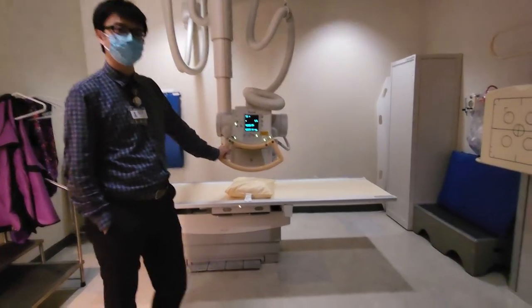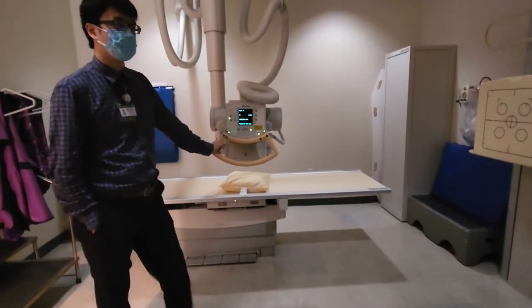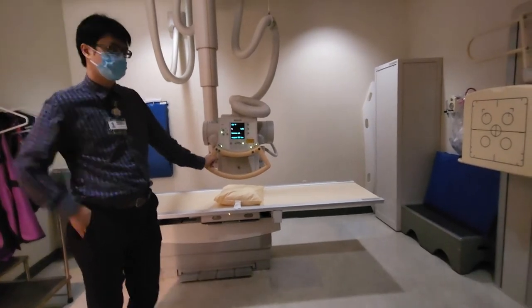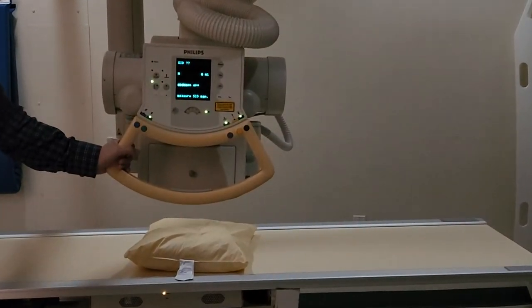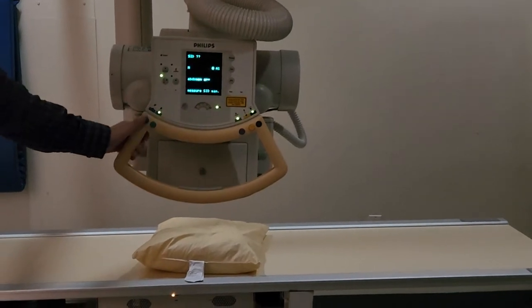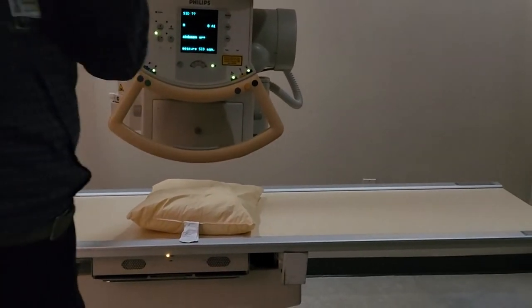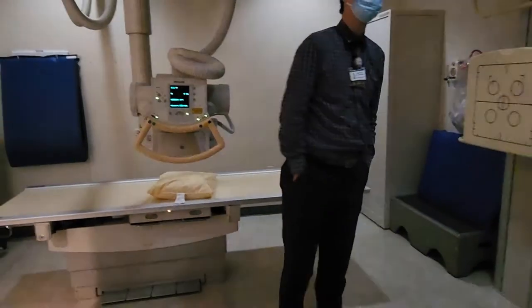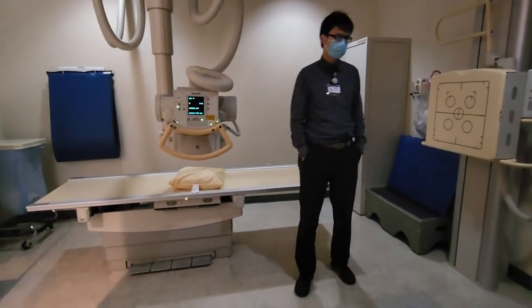We know how to move the machine around. Now we're going to be manipulating it, along with manipulating our patient, in order to do actual x-rays. Before we actually get to the positioning part, I do want to review ADIP again with all of you.